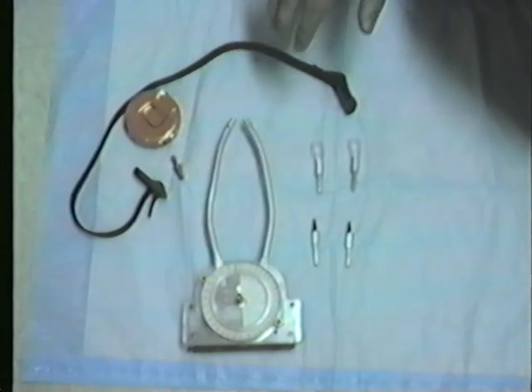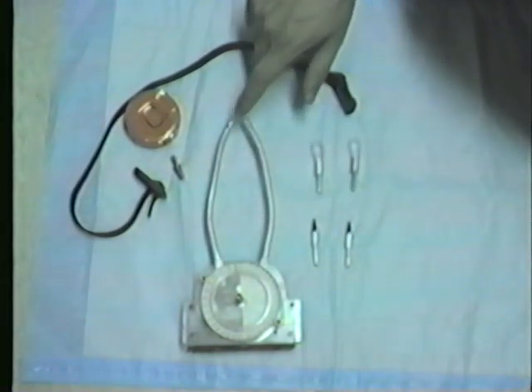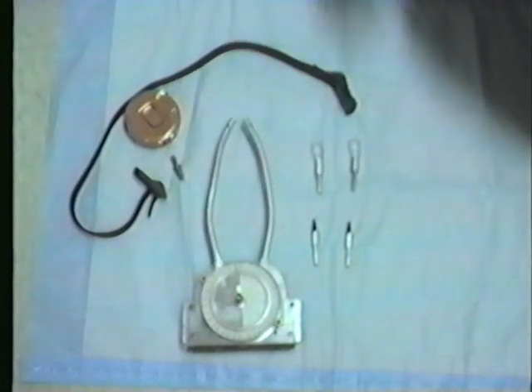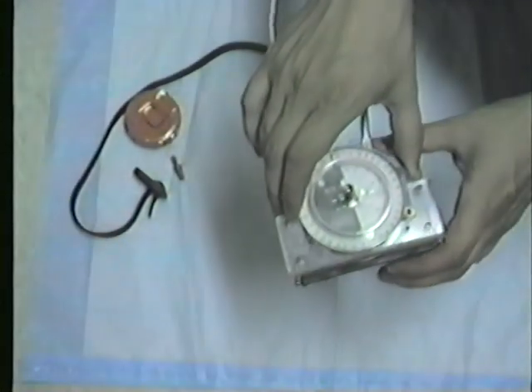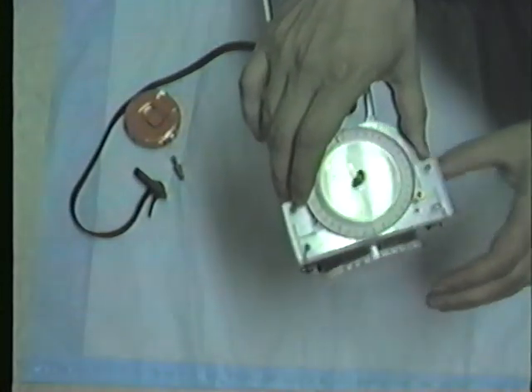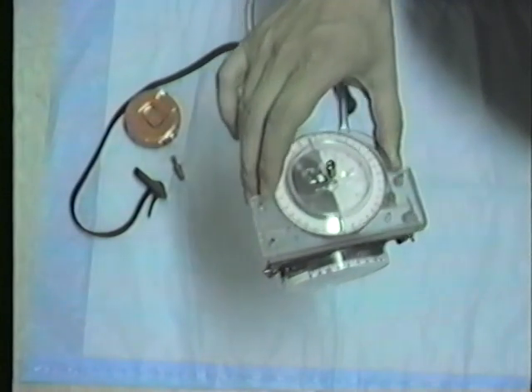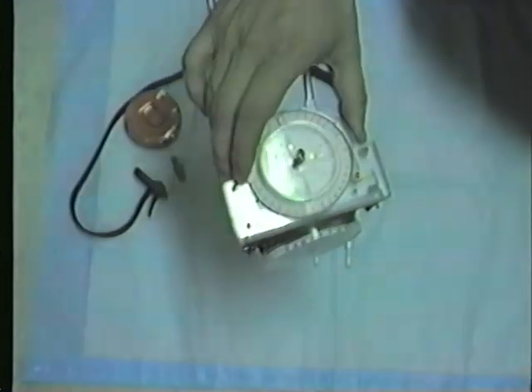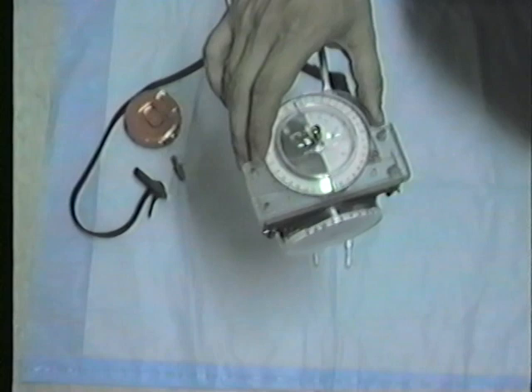The dial caliper is this top portion. The distance between the ends of the measuring arms is shown on this dial right here, which I will show later in a close-up. The inclinometer is attached to the bottom of the housing and can be released — it's just held there by a little magnet. Now you can see it hangs freely and will always align itself vertically, which is very important because if not always the same plane is measured, you will get different measurements of the same inclination.